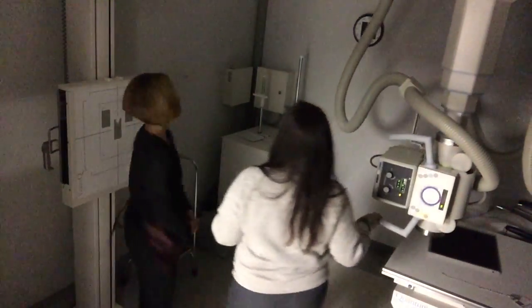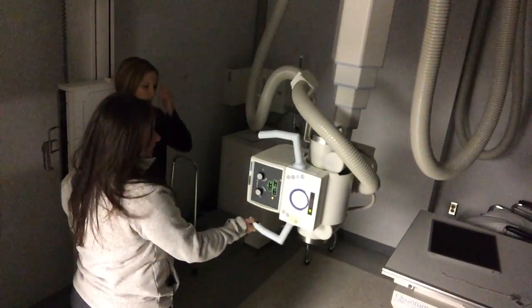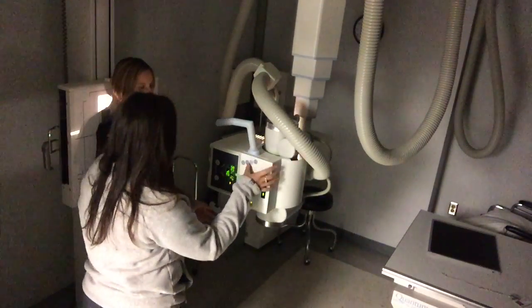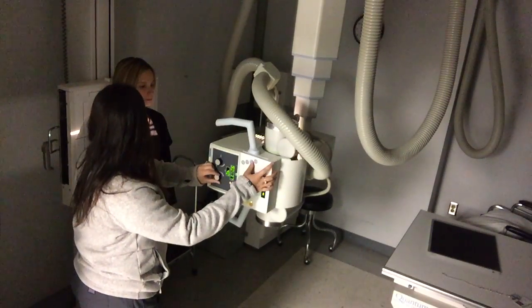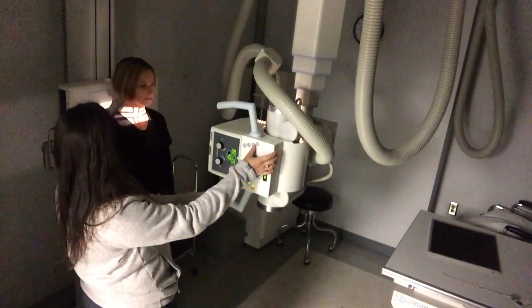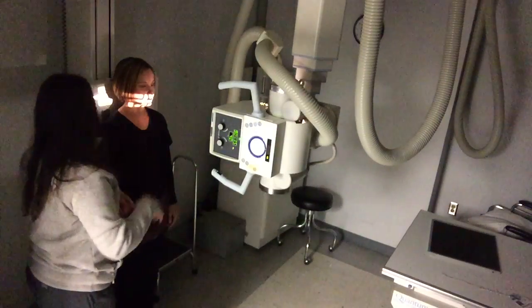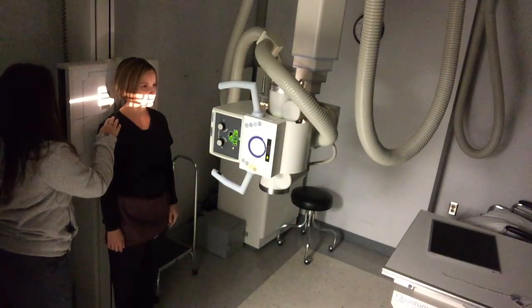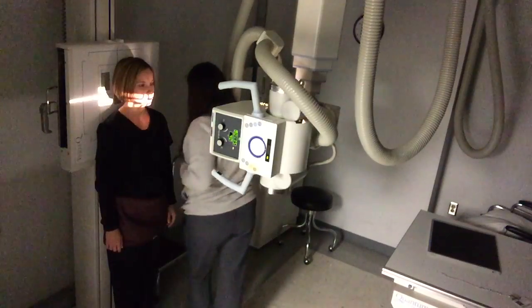I'm going to start with the open mouth because it's a little bit different — it's at a different SID. We're going to be in detent here at 40. I'm going to raise my light up and get it in the ballpark first, then adjust later. I'll first collimate down so I don't blind her when I raise this up. I usually put the centering point right below the mouth to start, then raise it behind the patient.